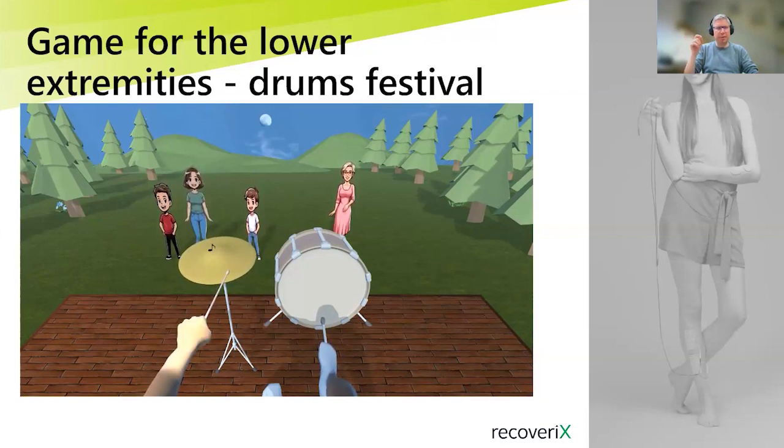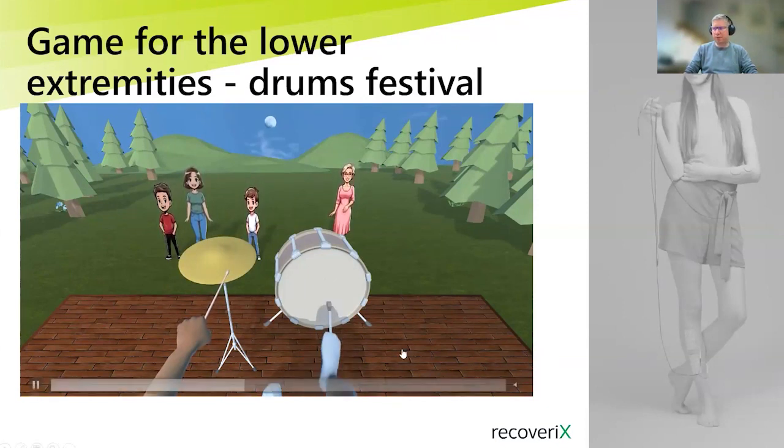If you play some trials correctly, then additional audience will appear in the background. So the better you play, the bigger your crowd will be in the end. On the other side, if you don't play some trials correctly, then people would disappear one after each other. It takes some trials until the next person would appear.